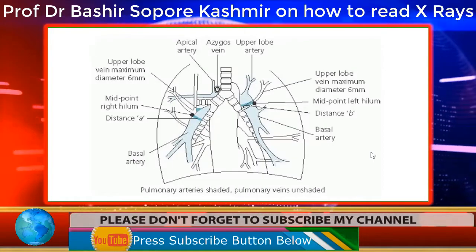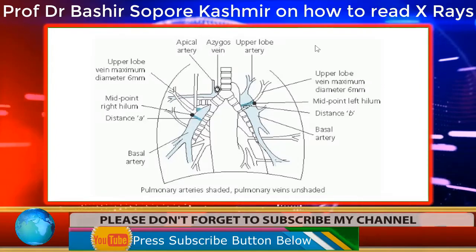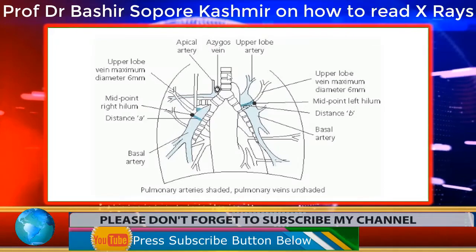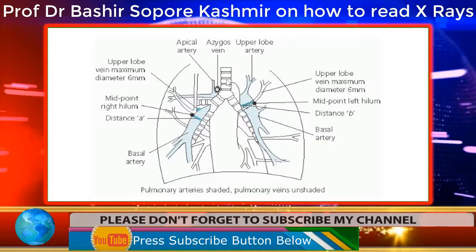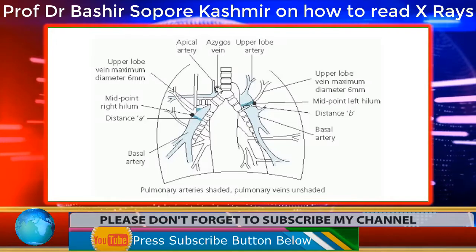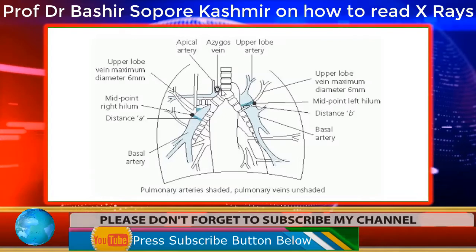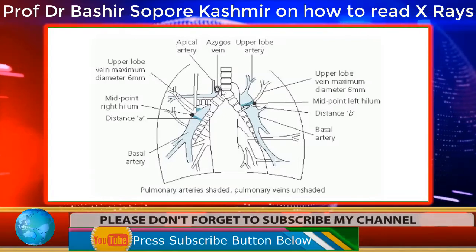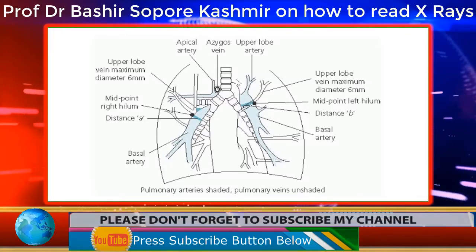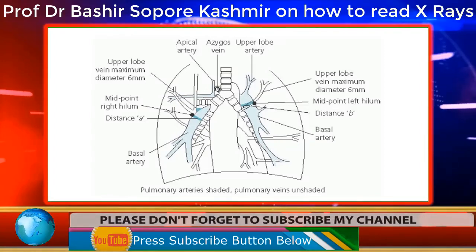Okay. Now, I show here one image. The only thing in this image I want to lay stress on is that this is the tracheobronchial area. So this is trachea and this is bronchi. At the tracheobronchial area, you find an opacity here. You understand my point when you look at X-rays. It may not be seen in all X-rays, but in some X-rays, you may appreciate it. So this will be the azygos vein. This is the place where you have to look for the azygos vein.